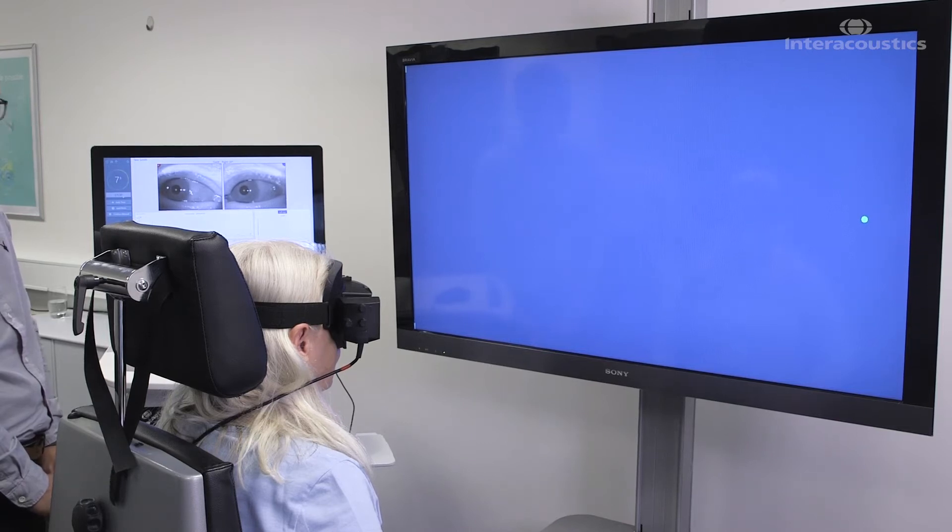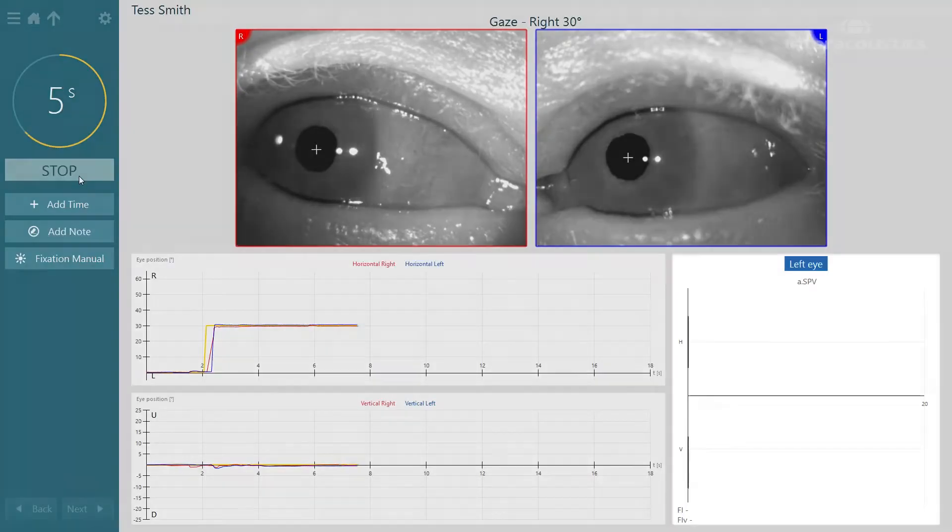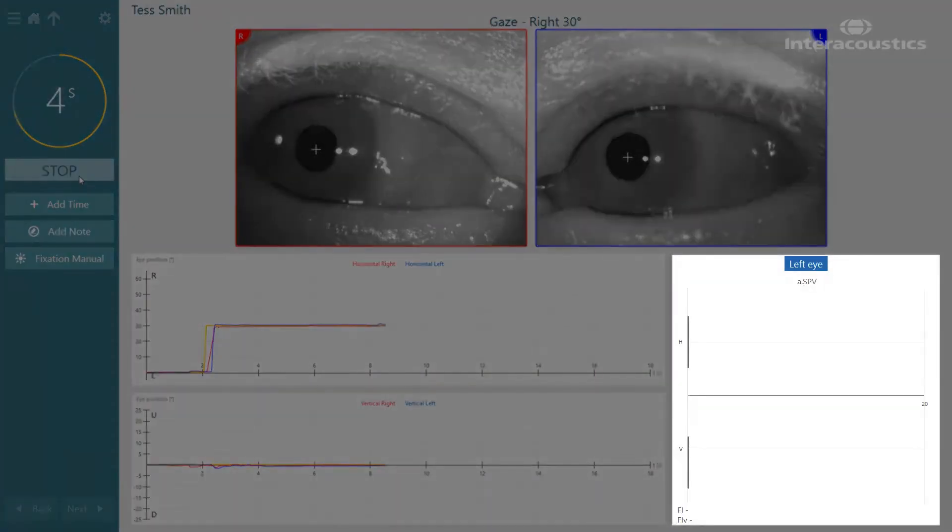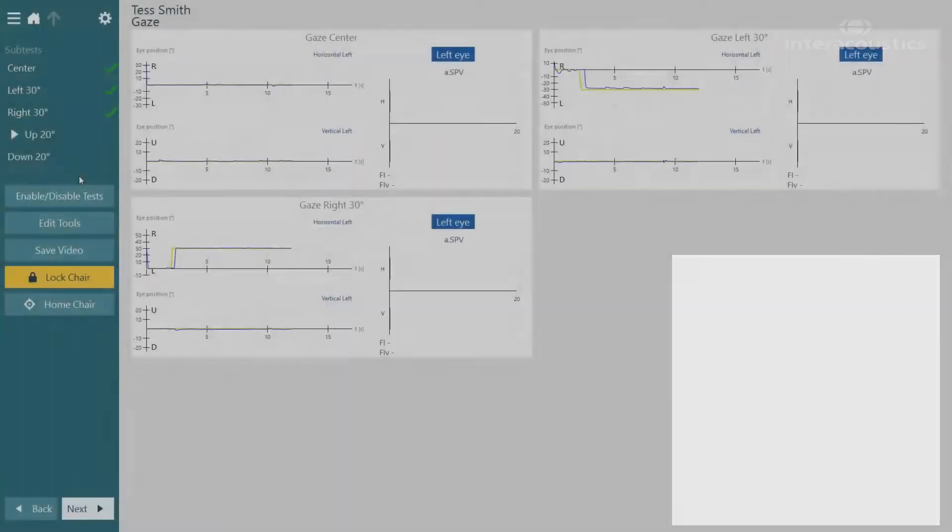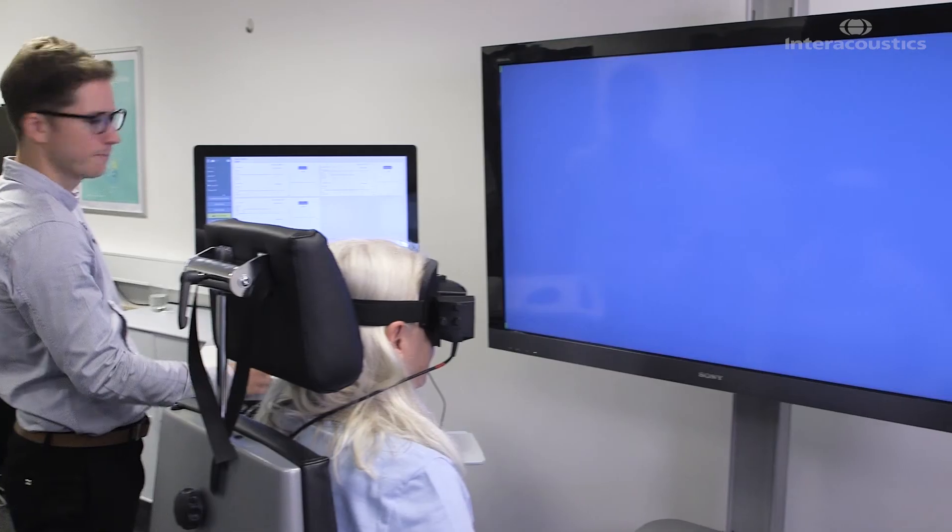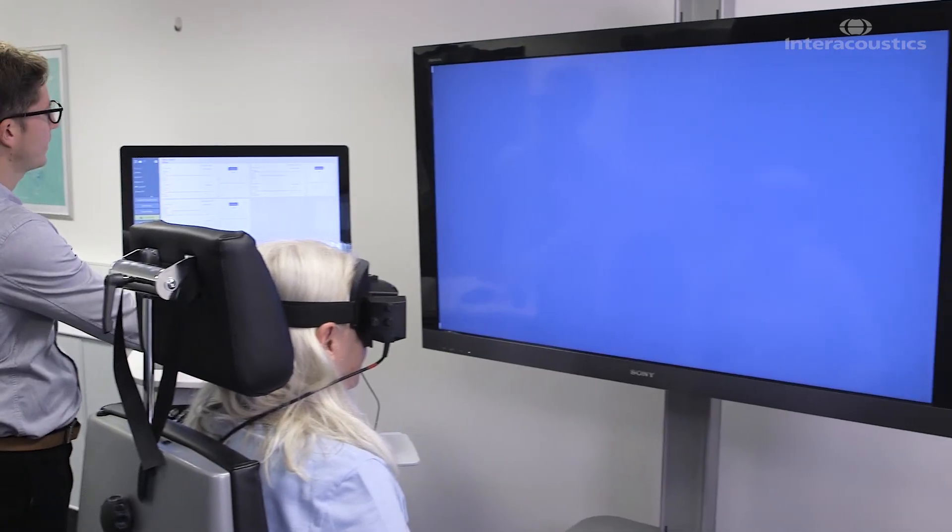If there was any nystagmus seen on this test we would see it on the average slow phase velocity graph on the right hand side of the screen. Okay, doing really well Tess.